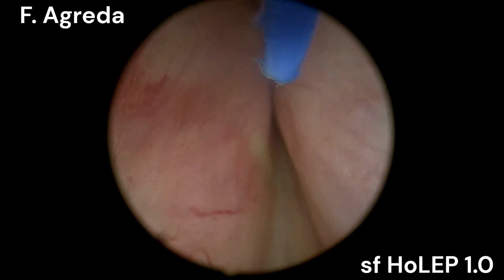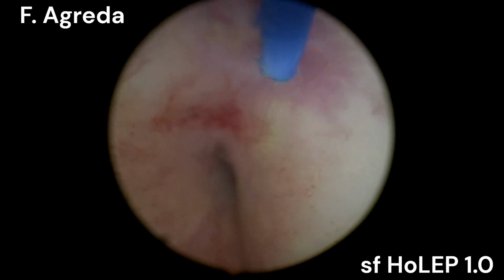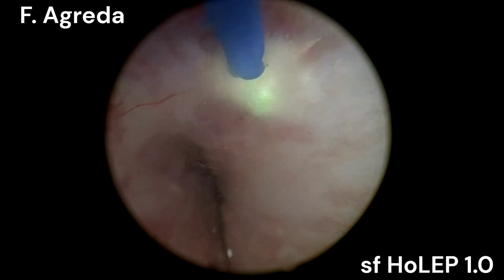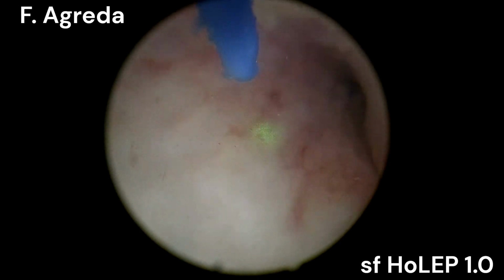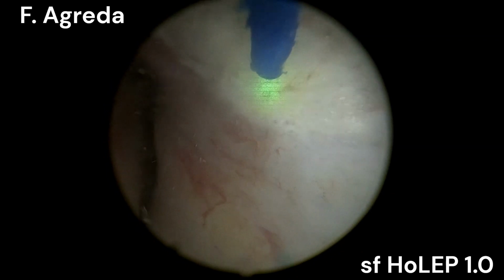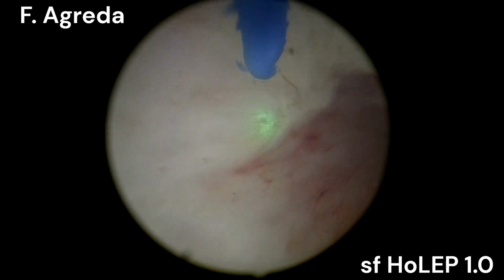The first step is always, as we can see I'm trying to do here, to locate the mucosa covering the external sphincteric mucosa, and you can see here I already localized it, and now I'm trying to start the dissection of the sphincter and sphincteric mucosa. So the first step is to cut through the urethral mucosa, as I'm doing here, in a very progressive manner. Has to be very progressive. You have to cut first through the urethral epithelium, then through the urethral fibers.